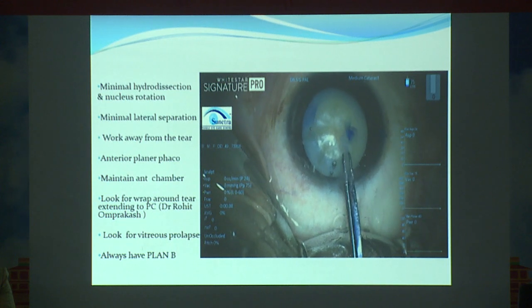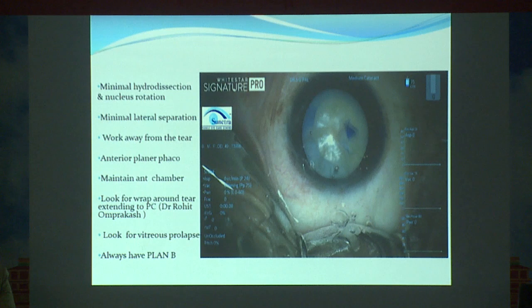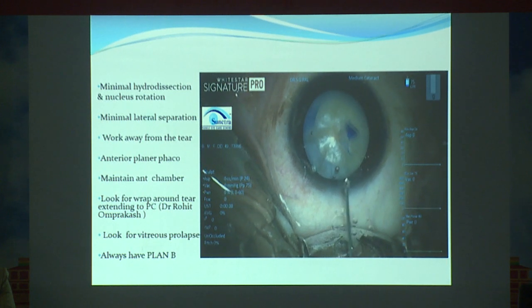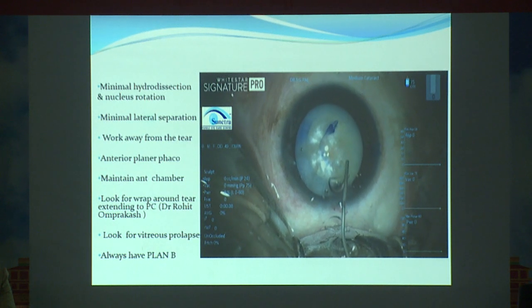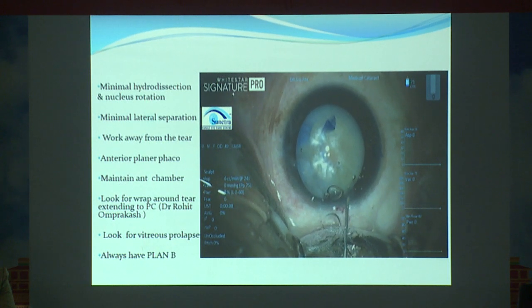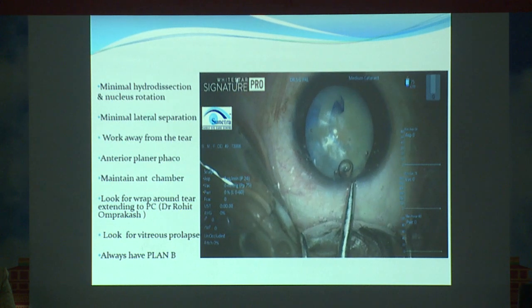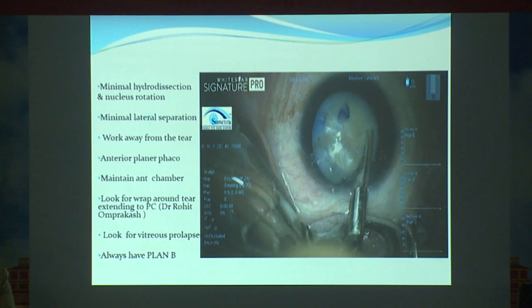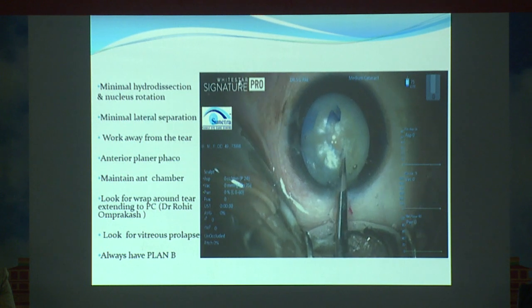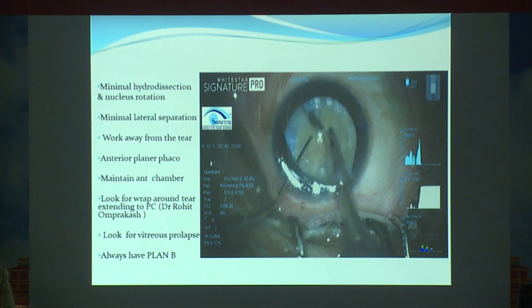And I realized that when it went out, it had gone out at 2 o'clock. And because it is close to the side incision, I couldn't rescue it back. So there are several ways of managing this stage. You can go in from the other side and bring the rhexis in there, or you can cut with the Vannas scissor and complete whatever rhexis is there, but you have to remember your capsule is open there, your bag is open there.